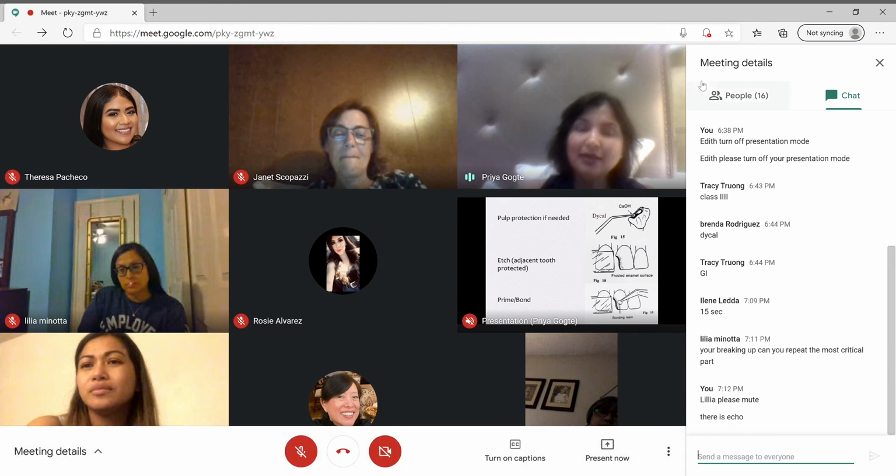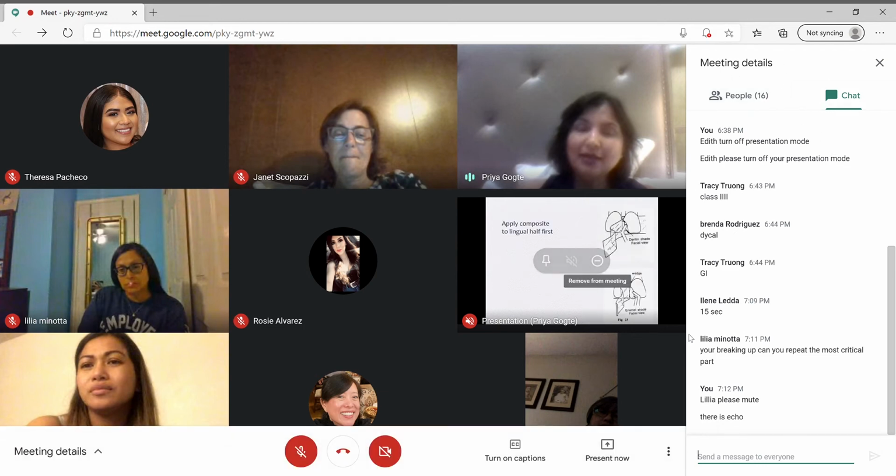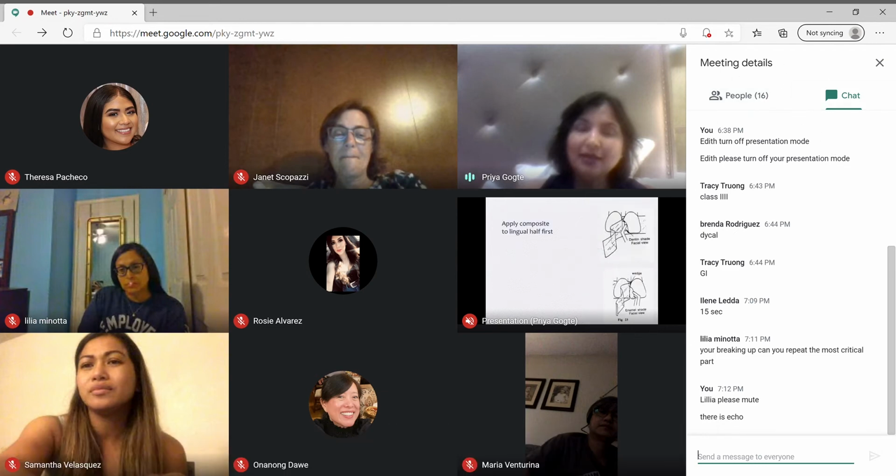And you can do different shades. You want to put a translucent shade in the back. In my slideshow I said transparent, but I don't mean transparent, I mean translucent shade.